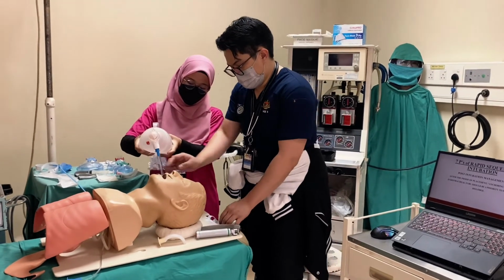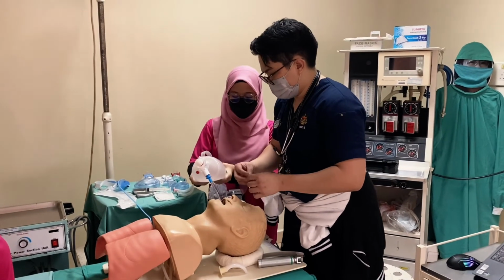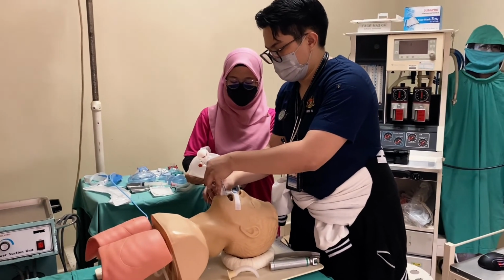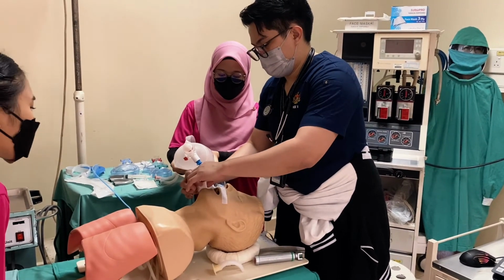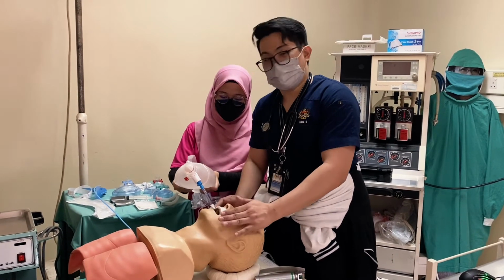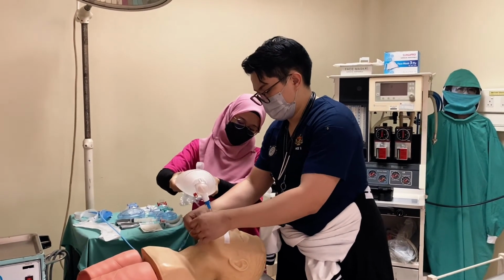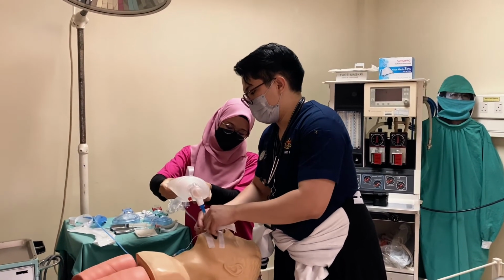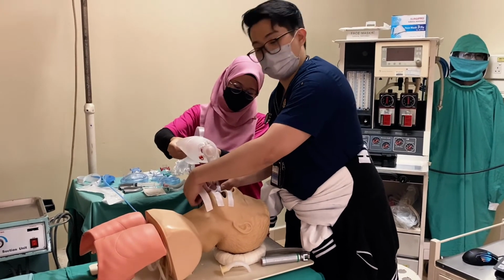So as I showed before, the endotracheal tube tape, we anchor it just like on a real patient. There are different techniques in different cases, but so far I will be showing you how the technique goes in our anesthesia department, in my workplace. If we put this, it will be easier for us to ventilate without worrying about the tube becoming dislodged.